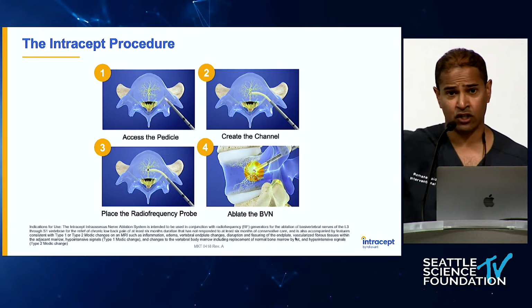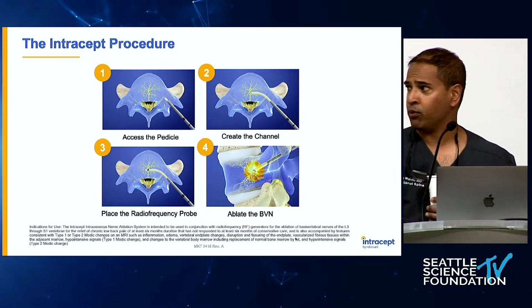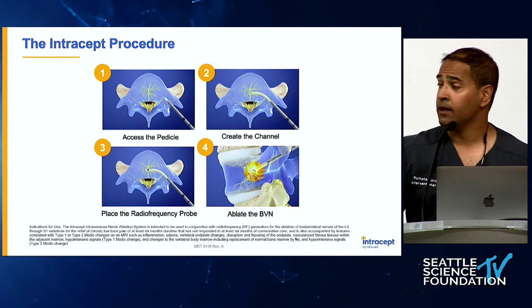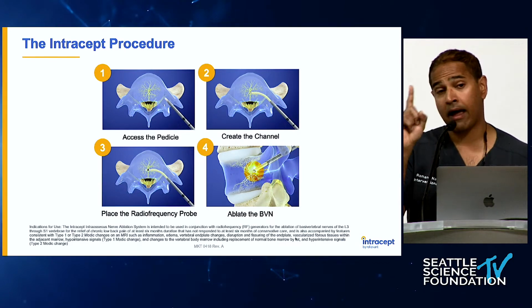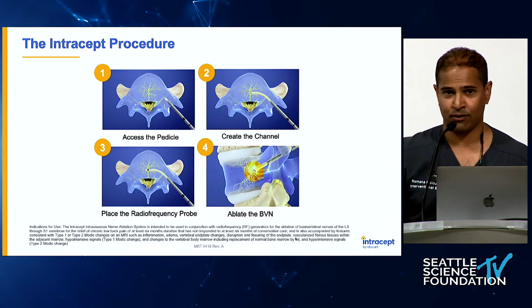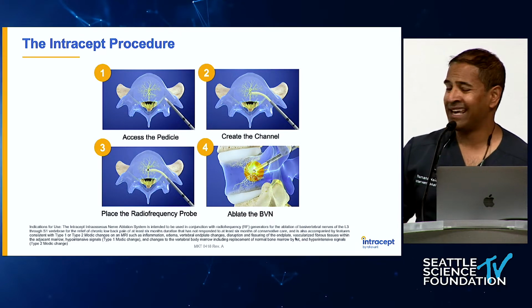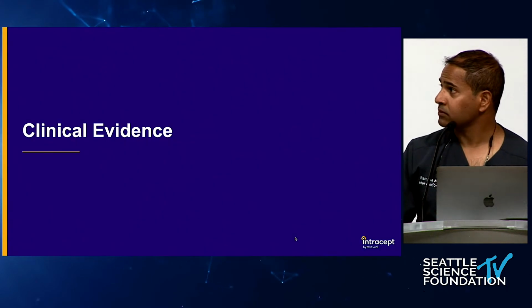Our standard lesion, which used to be a 15-minute burn, created about a 1 to 1.2 centimeter diameter lesion. Now we have a 7-minute lesion. It has 85% of the volume as a standard lesion. So if you're on target, you're right where you want to be fluoroscopically, then you can do a targeted lesion. So I would say 98% of my lesions now, especially in the lumbar spine, are targeted. At S1, you may still consider standard depending on where you end up.